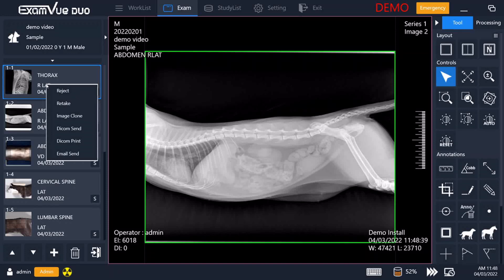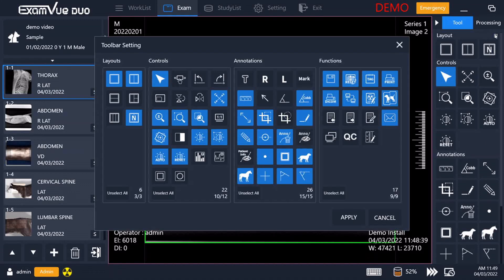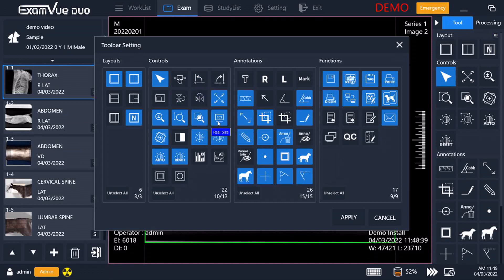While you're taking the X-rays, you'll have access to the full suite of tools in ExamView Duo. On the right is the toolbar, which will present to you a large number of tools, and you can personalize it to show you exactly the tools that you are looking for. Many practices will not need every tool, so you can go and just pull out the ones that are most useful for your practice.